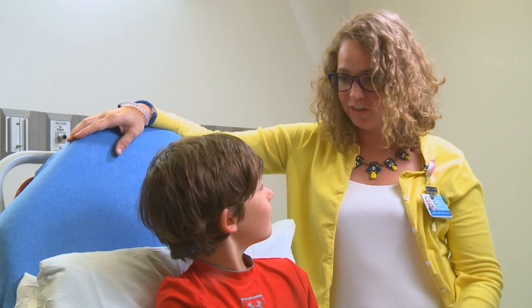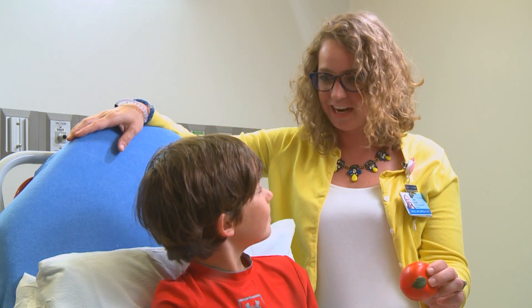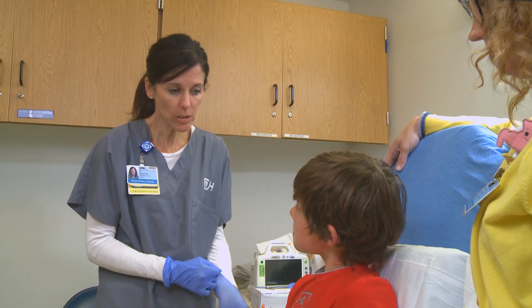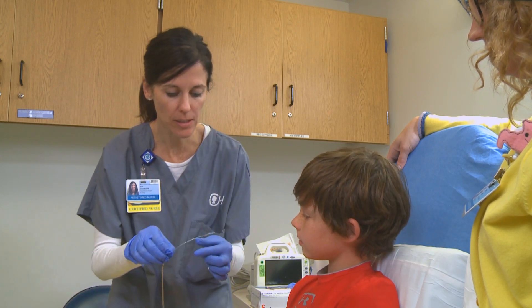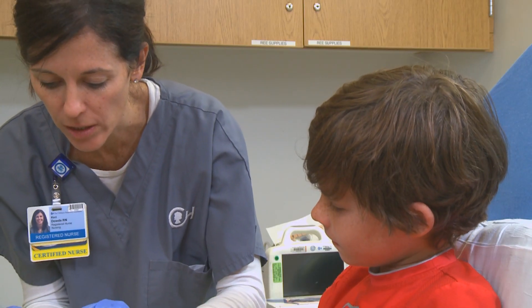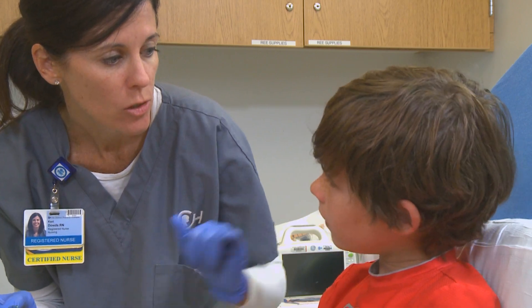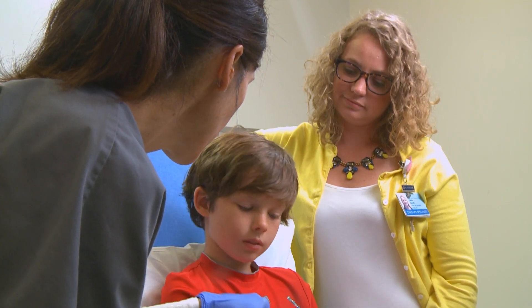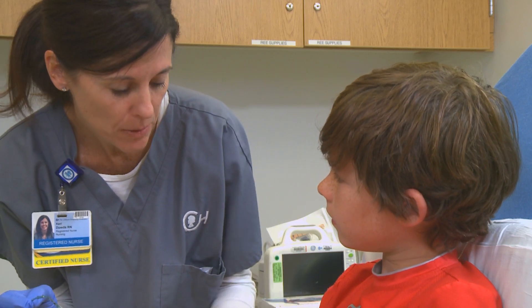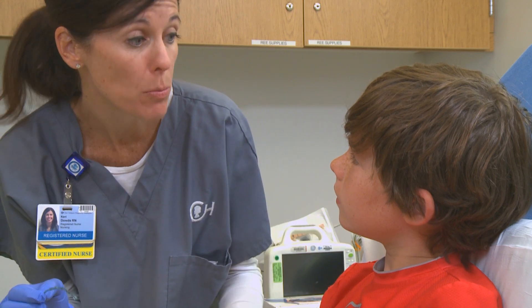Remember, just like we talked about, your job is going to be to squeeze on the stress ball and take nice big swallows when I put that tube in. It's a really, really thin probe — not even as fat as spaghetti. I'm going to put this special jelly on the outside so that'll help the probe slide in. We're going to put it in your nose and it's going to go down into your esophagus. Once it's where we want it to be placed, we're going to put the special tape on the side of your cheek and that keeps the probe in place.